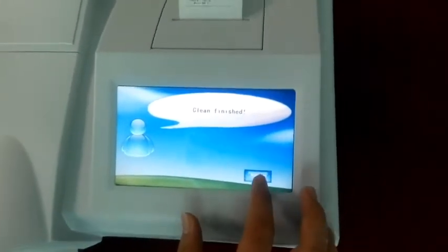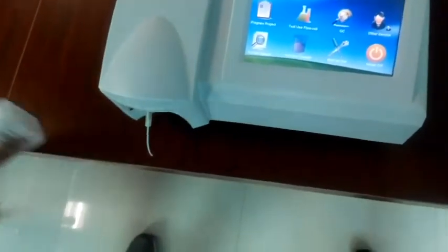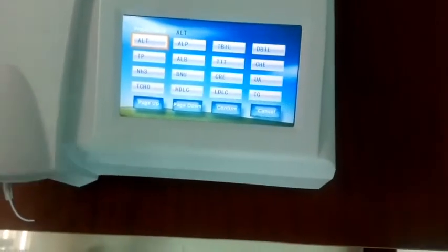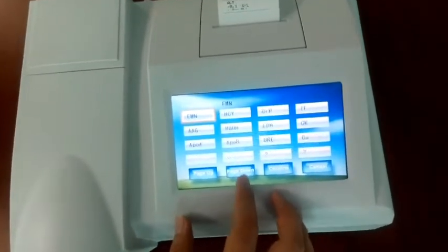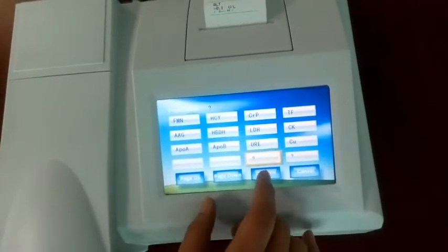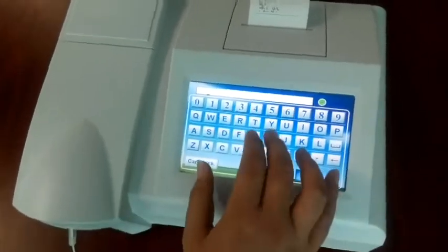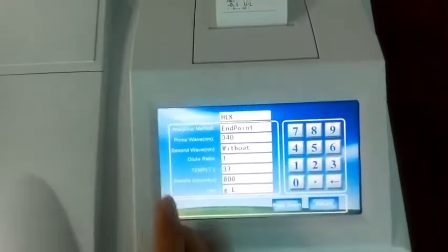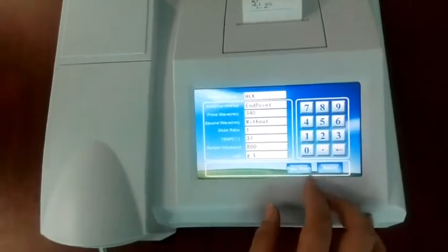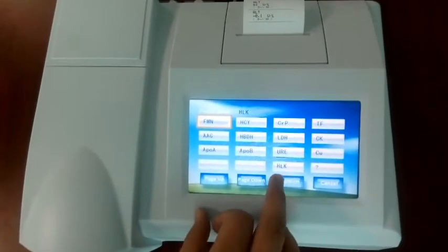After finishing washing the tube and the flow cell, we return to the main menu and we can now do the test. From the program list you can see more than 14 items you can test. If you cannot find the item you want to test, you can edit it — click it, confirm, write in the item name, for example HLK, confirm, set the parameters according to the reagent menu, then save and return. Now you can find HLK in the list.